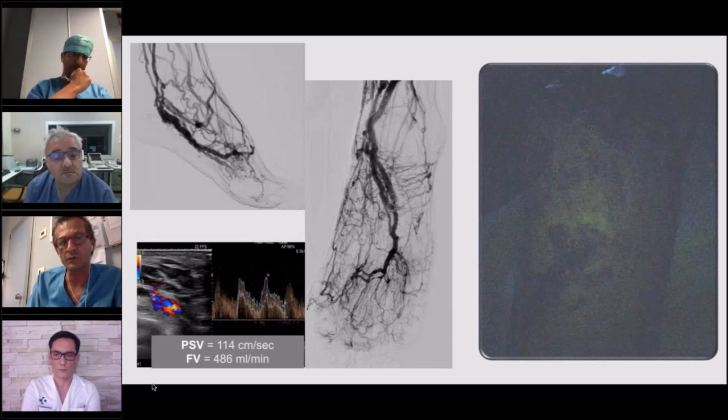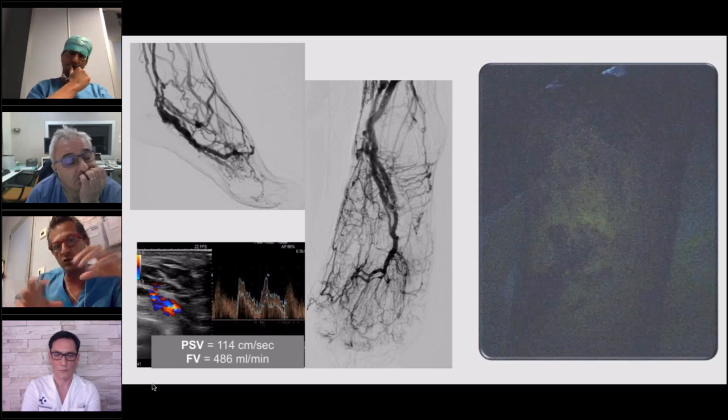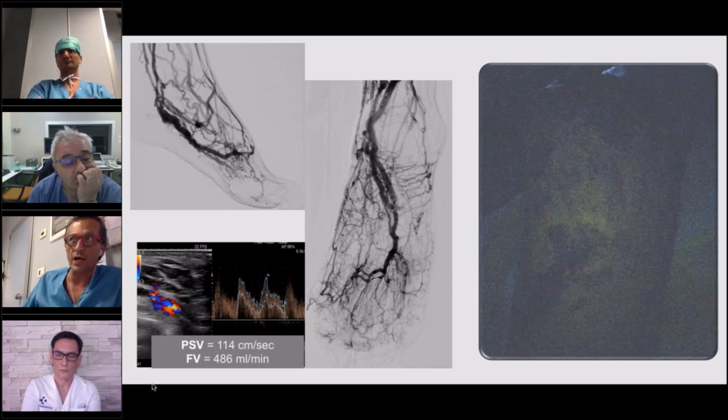This, in order to obtain this final result, a very good distribution of this arterial flow through every vein into the foot, which is very important. We can see in the duplex study, we obtain an effective flow rate into the foot, like in this case, with a flow rate of more than 400 milliliters per minute.